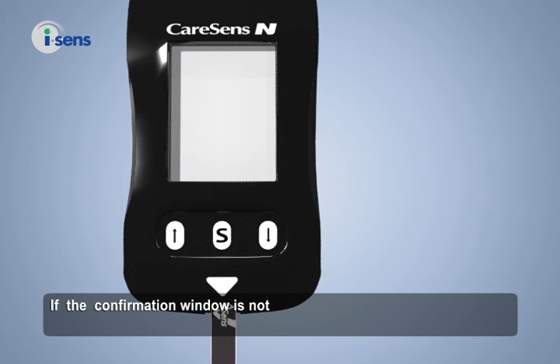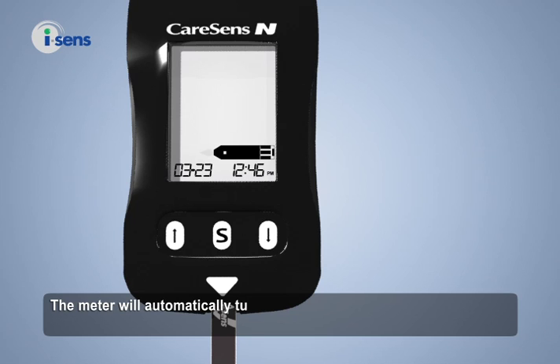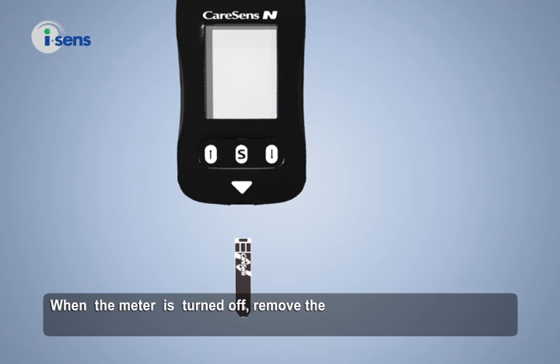If the confirmation window is not fully filled with a blood sample, the meter may display ER4. The meter will automatically turn off when a blood sample is not inserted for 2 minutes after the blood insertion symbol has appeared. When the meter is turned off, remove the test strip and reinsert it to test.